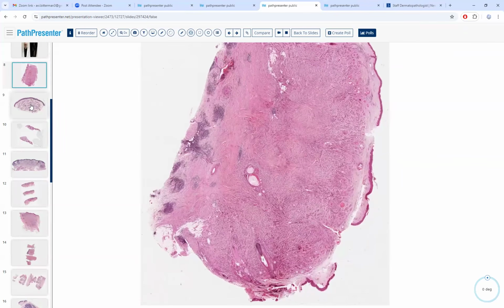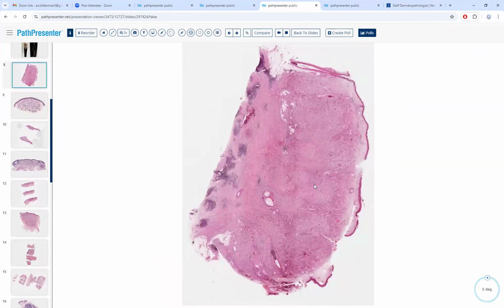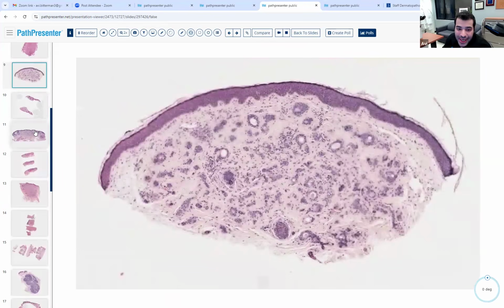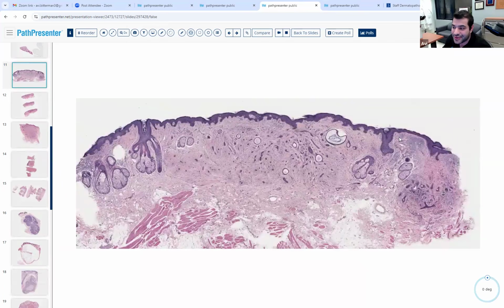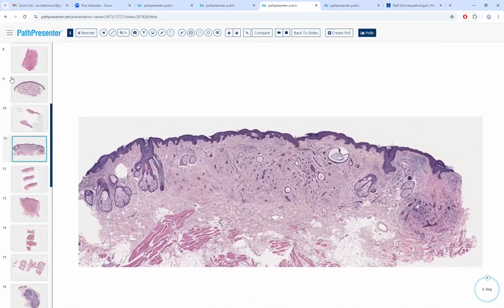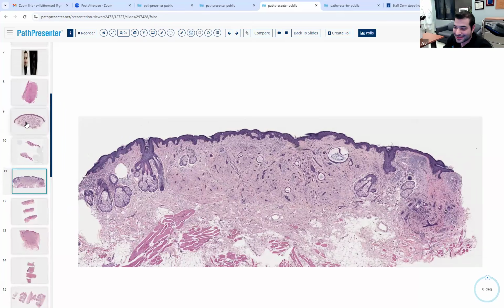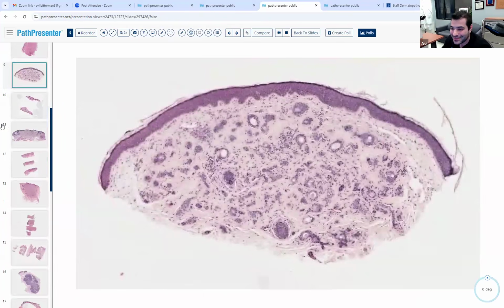Clinically, the workup criteria for our Paisley tie pattern, you would see more so a central dell on desmoplastic trichoepithelioma, but we didn't see these on the last two. Oh, I see. You may not see central dell on path. I know you can see it clinically. For example, do you see a central dell over here? May have to step into this to do it. No. But I don't want you to rely on that. Like, oh, I don't see a central dell, so it can't be a DTE, right? So we'll go by the histologic features. So yes, you're right. Syringoma, exactly.